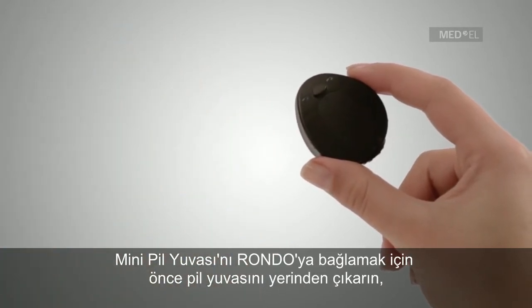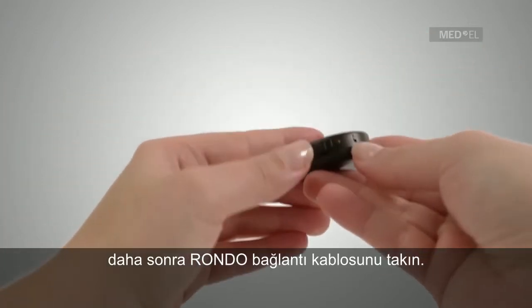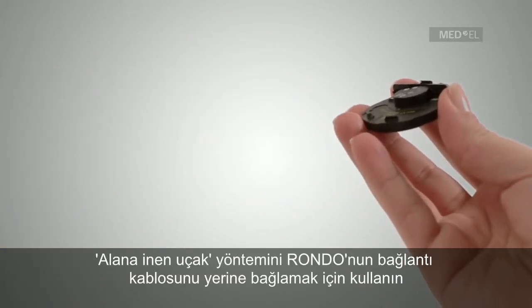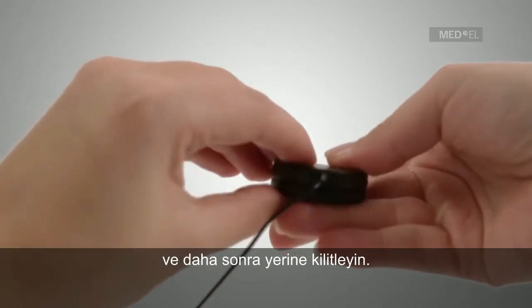To connect the Rondo Control Unit to the Mini Battery Pack for Rondo, first remove the Rondo Battery Pack and replace it with the Rondo Connection Cable. Use the gently landing airplane method to attach the Rondo Connection Cable, then lock it into place.